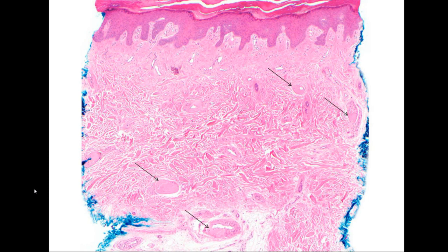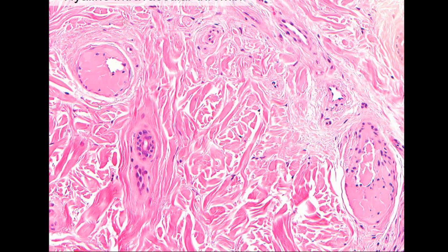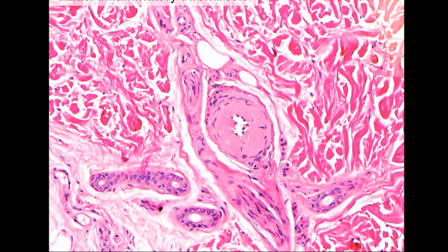The skin biopsy shows acral skin, as noted by the stratum corneum here. And again, significant lack of inflammation, and I draw your attention to the foci highlighted by the arrows. At this power, there seems to be thickening of the wall of the vessels. But upon closer magnification, one notes that there's actually been recanalization of the vessels by a process that's actively thrombosing. And there's a unique quality to these more developed thrombi as shown here. They have a waxy, cracked appearance. Notably, there's no inflammation surrounding these involved vessels.